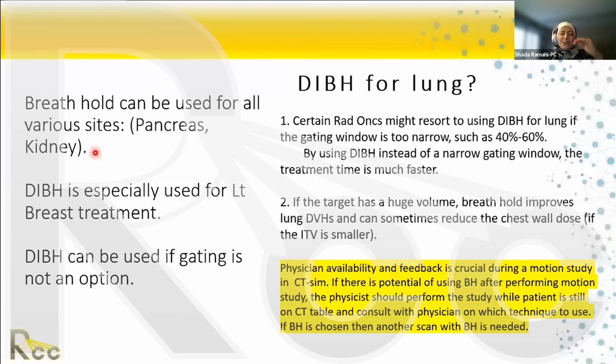You are going to spend a long time on the LINAC to treat the patient. The patient will spend more time not being treated than treated. So in this case, the physician told me that they will consider DIBH. You could also consider DIBH if you want to reduce the chest wall dose. You want to have maximum separation between wherever the tumor is and the chest wall. And that, again, is a clinical decision. As a physicist, I wouldn't know if this case is good for DIBH or not.